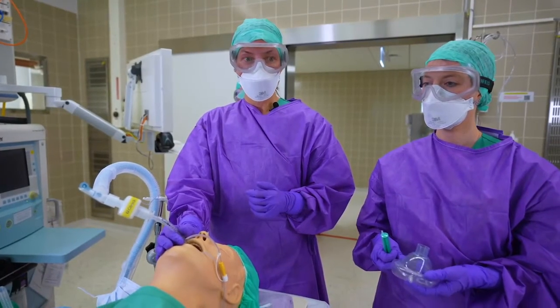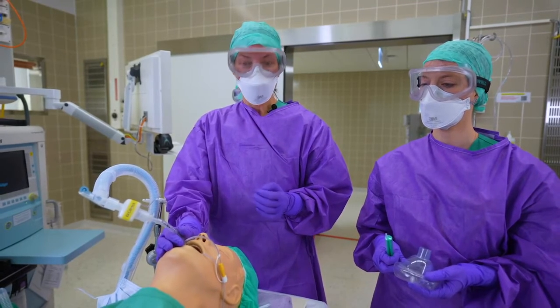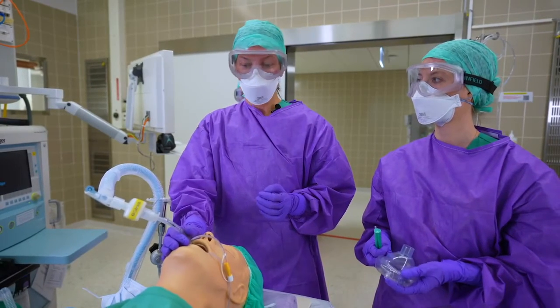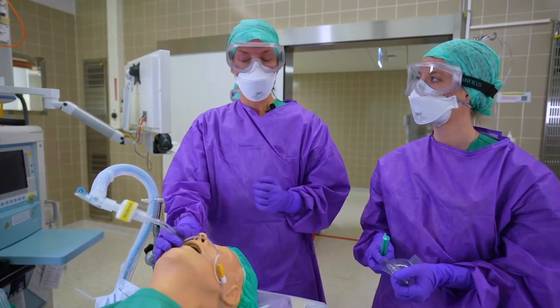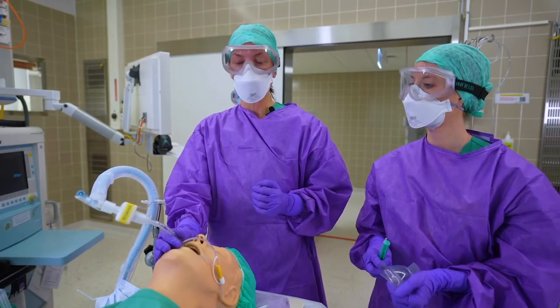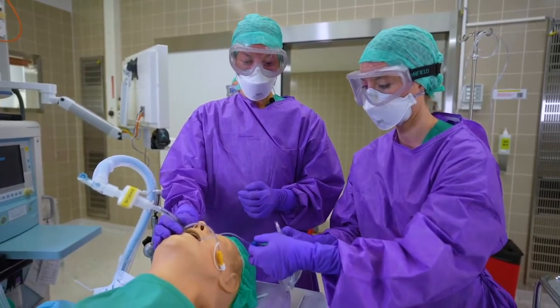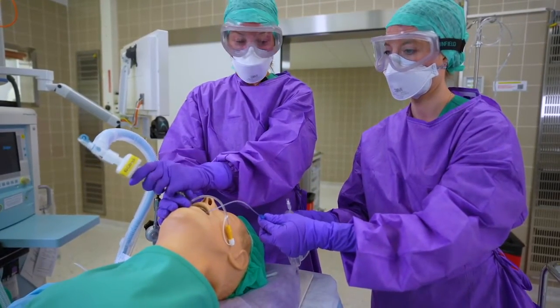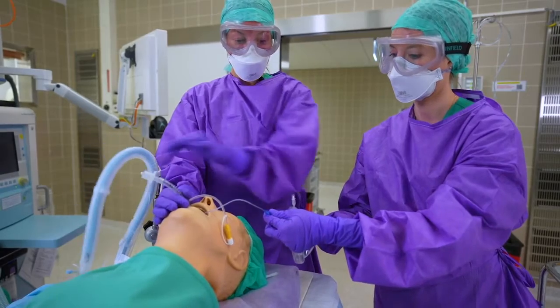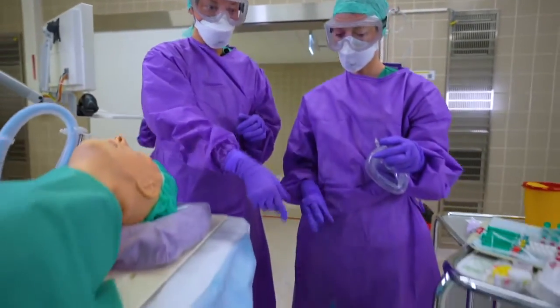It is important to avoid coughing when you extubate the patient. Here, IV lidocaine or remifentanil come in handy. When you extubate, you're not utilizing positive pressure, but rather you're deflating the cuff and pulling the tube. We dispose of the tube right away.